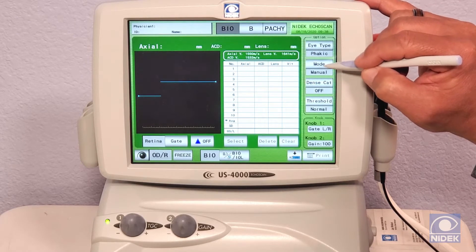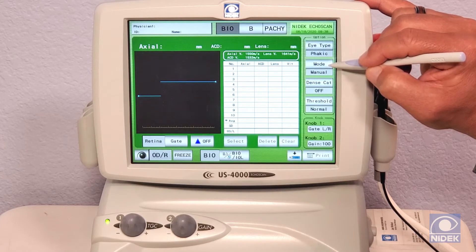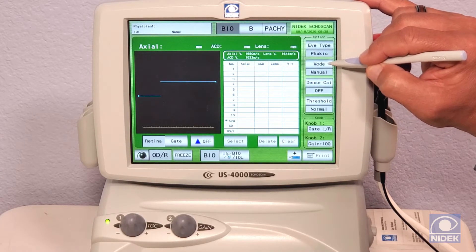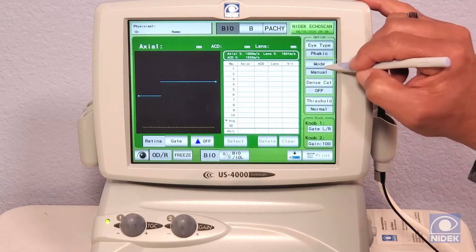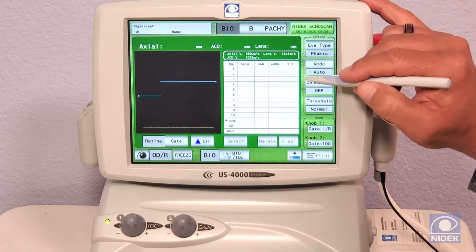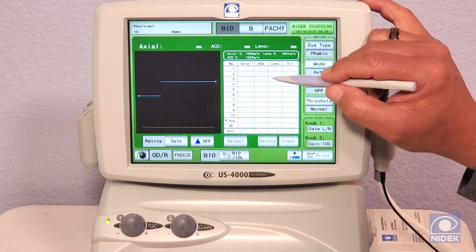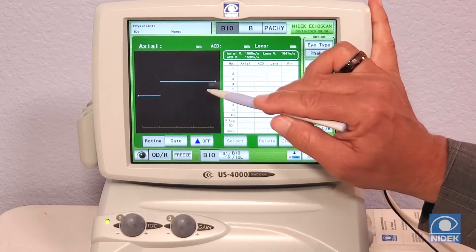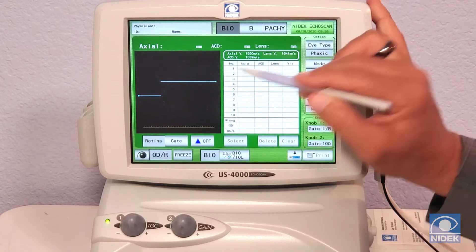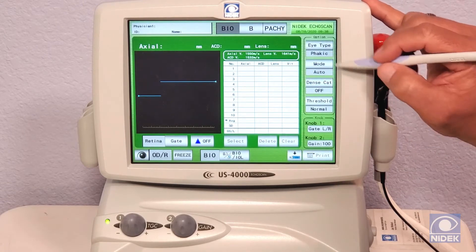Manual is where you can press the foot pedal for each individual measurement. And auto will give you 10 measurements automatically once the waveform hits the threshold.